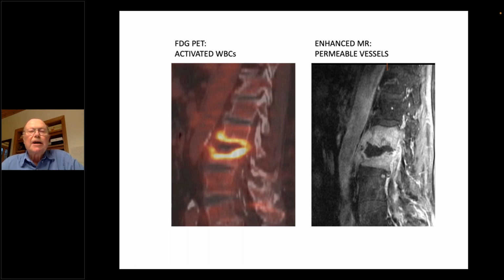differentiate mechanical inflammation at the margins of a joint and infection, in the presence of successfully treated infection, and to recognize abnormal infection in bone, soft tissue, or in the spinal canal, whereas MRI cannot.